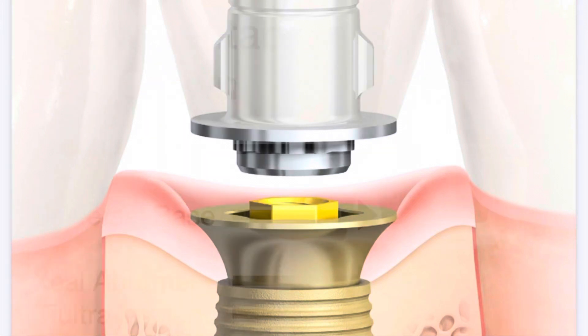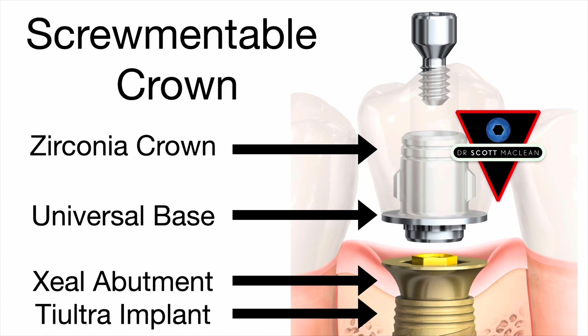Hello, this is Dr. Scott McLean and during this video we'll be showing you how to make a screw-mentable crown. The screw-mentable crown is a crown that is put together with cement outside of the mouth and then screwed in place.